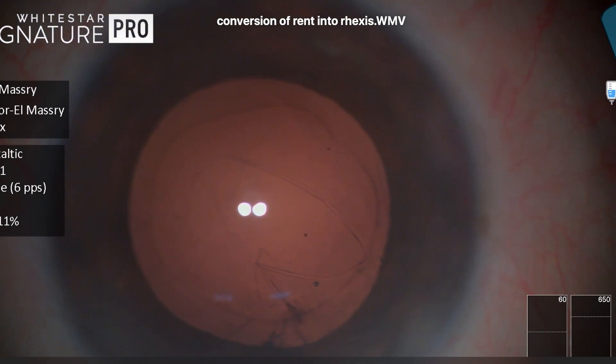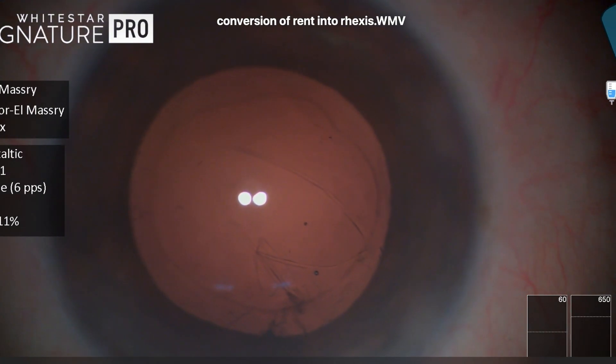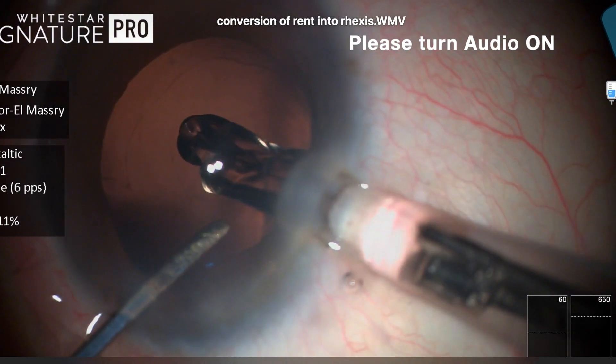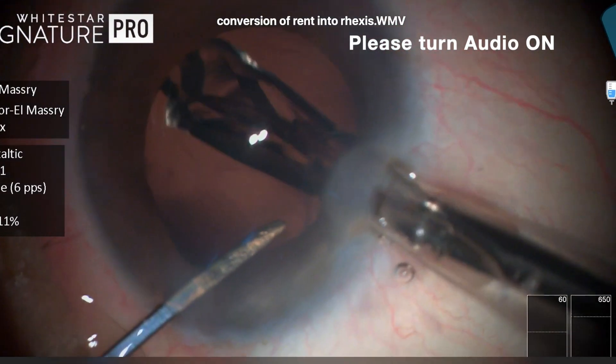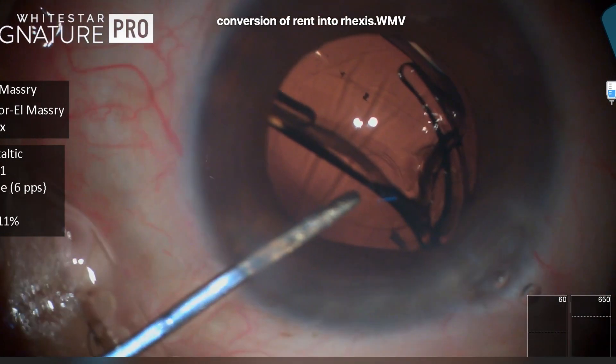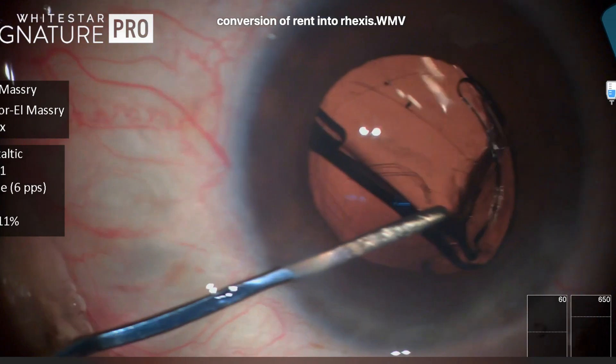Now this is a completely oval capsular tear with no sharp edges, and the bag is a bit extensile, so we put in viscoelastic. Then I implanted a hydrophobic single-piece acrylic lens — this is the Sensar one lens.